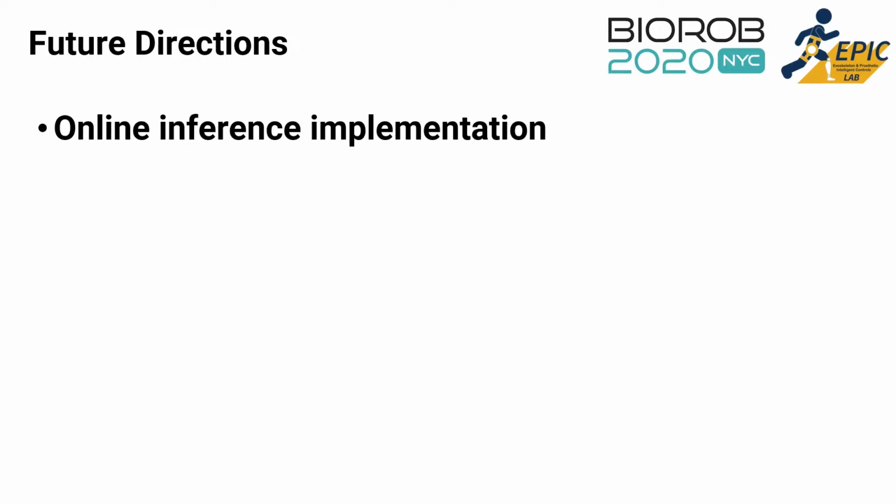One of the limitations of our study was that this was an offline analysis. Literature studies indicate that real-time performance can have an effect on mode classification performance, which is not accounted for in an offline analysis. Therefore, ML model performance validation in real-time implementation is needed for future studies.